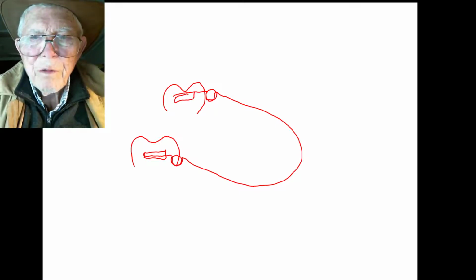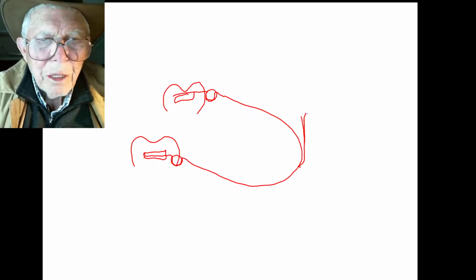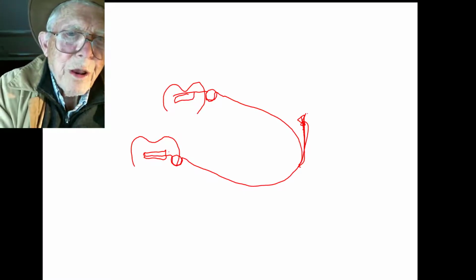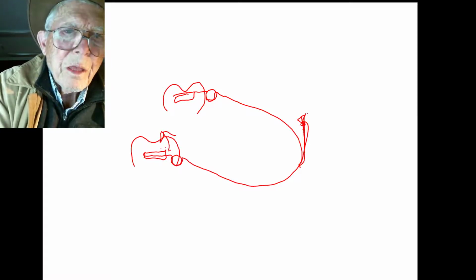Now, if I raise this up, but it wants to go down, see, and I'm going to pick it up and hook it to these teeth over here. Now, as I pick it up, that's going to tend to rear this tooth up in this direction, see.